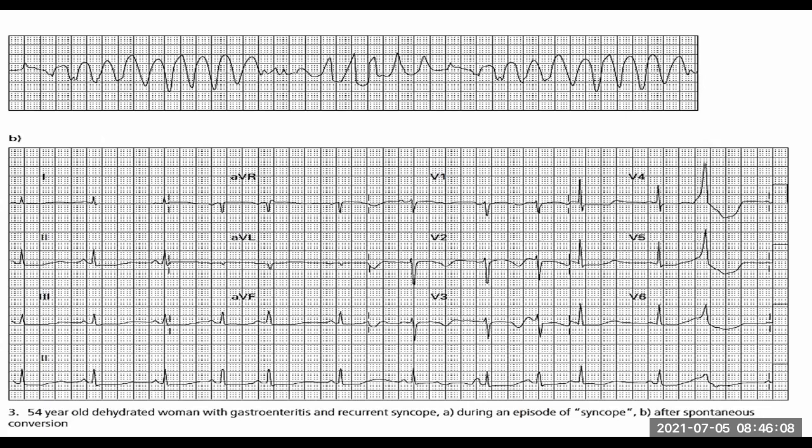So if you ever get lost or confused, the machine normally helps you out because it starts at a sort of in-between. It starts at 100, right? So 100, if you give it to a supraventricular, you're not going to kill the patient. You give it to a ventricular, you're also not going to kill the patient. But to be very technical, when you have a narrow complex tachycardia, you start at about 50 joules, 70 joules, 100 joules. And when you have a wide complex tachycardia, you start at about 100, 150, and things like that.